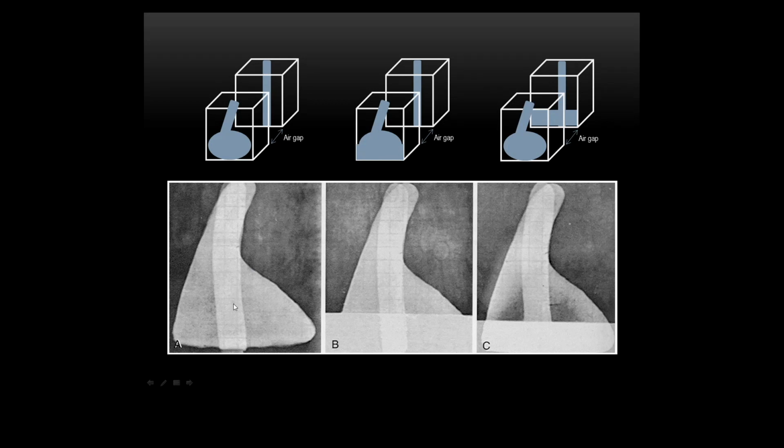Now, the reason you can see the anterior and the posterior structures clearly is because you've got an air gap between the 2. So that air gap creates that interface. Does that make sense? So what they then did is in the anterior box, they poured some water. So the water matches the density of the heart.